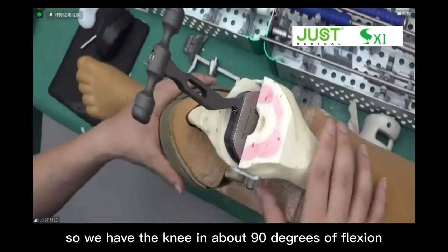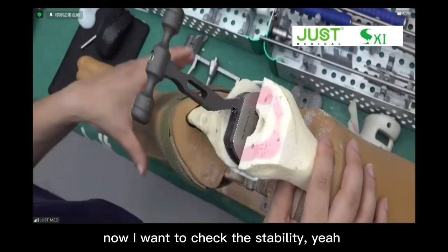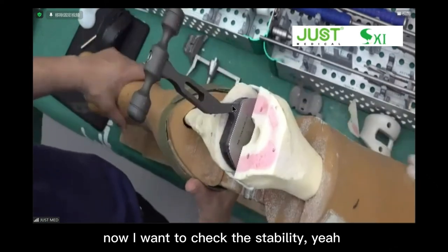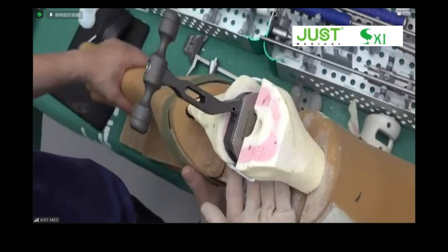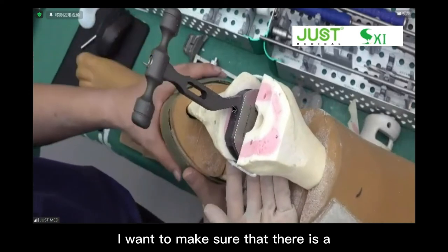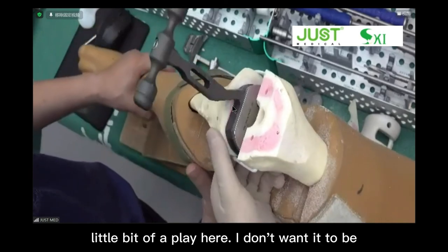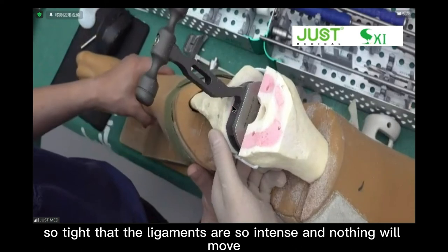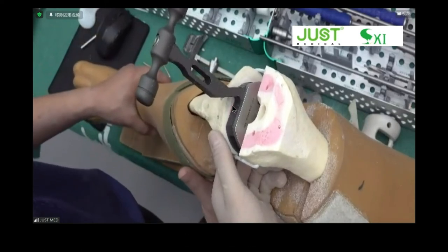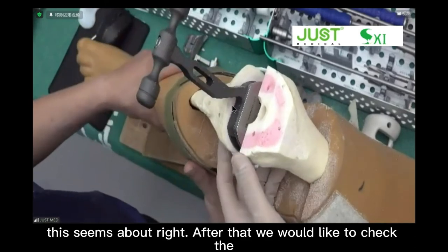So we have the knee in about 90 degrees of flexion. Now I want to check the stability. Yeah. It looks very good. I want to make sure that there is a little bit of play here. I don't want it to be so tight that the ligaments are so intense and nothing will move. That is no good. So just by feel, this seems about right.